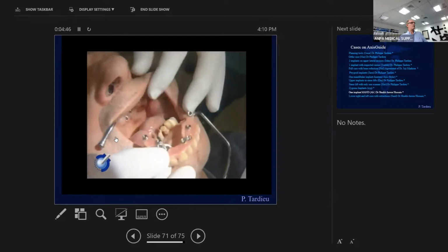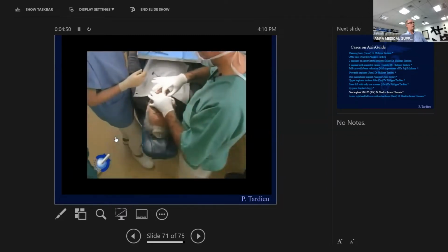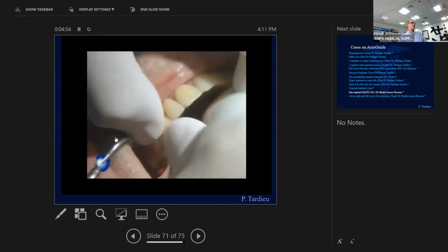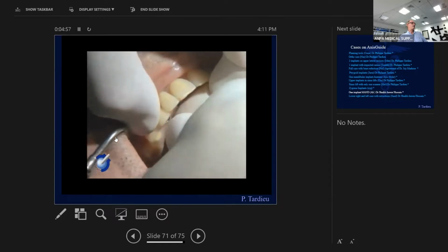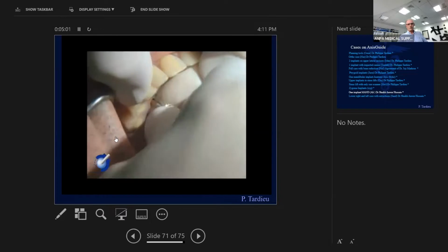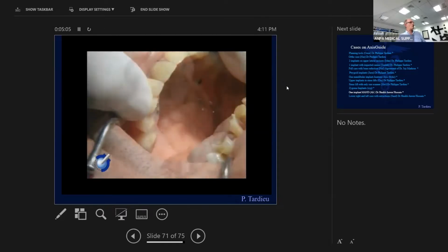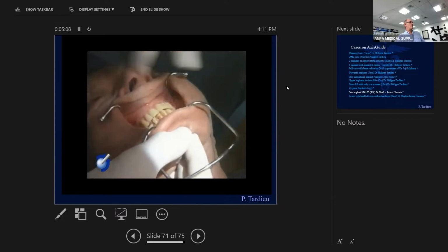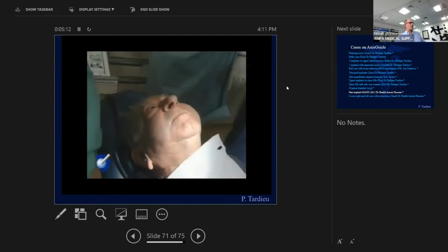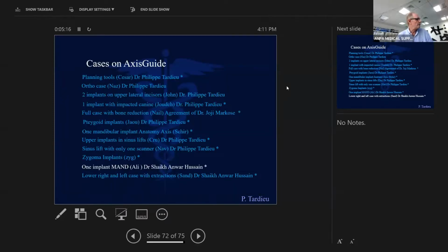You see the conical abutments? The two pterygoid implants at the back with no teeth on top, and I screw retain the bridge, and I check the occlusion. And at the first bite, we know that it is perfectly adapted. Okay, so once again, this is the way to work on the Zygoma implants, avoiding sinus lift, avoiding big bone grafting, and allowing treating patients in a good way.